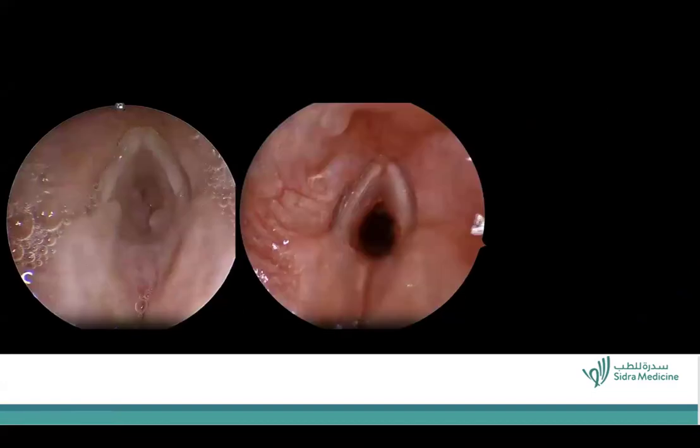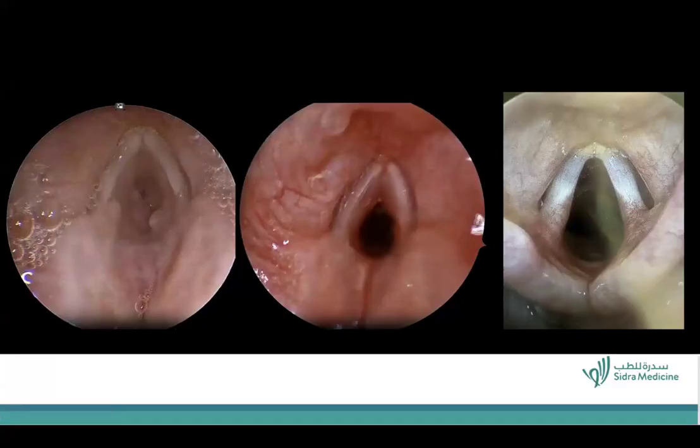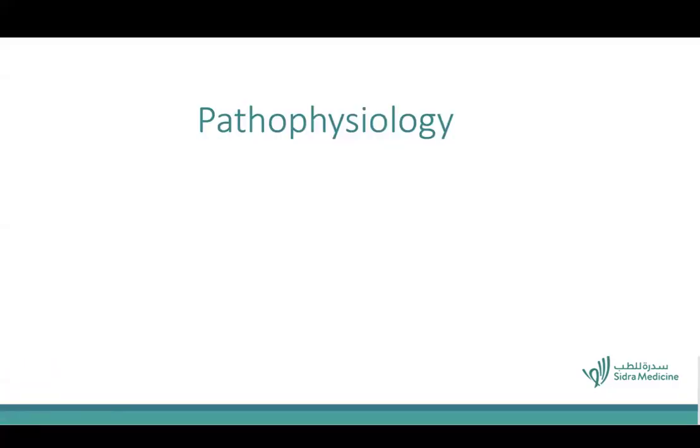In this patient, we were lucky because the patient still had a nice soft stenosis, so we were able to get a good result. It did take 2 to 3 endoscopic procedures, but we eventually got a good result. But if this patient had presented a little later, then we may not have gotten this kind of result.